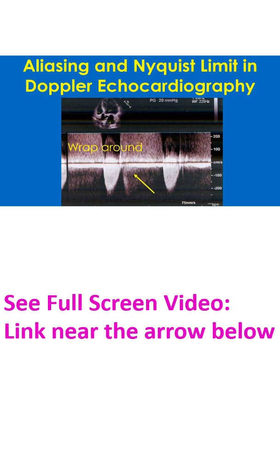This high pulse repetition frequency Doppler recording shows an aortic regurgitation jet above the baseline with a cutoff at the upper end and a wraparound seen below the baseline. Aliasing is seen here because the limit has been set just above 200 cm per second, while the velocity of the jet is higher than that.